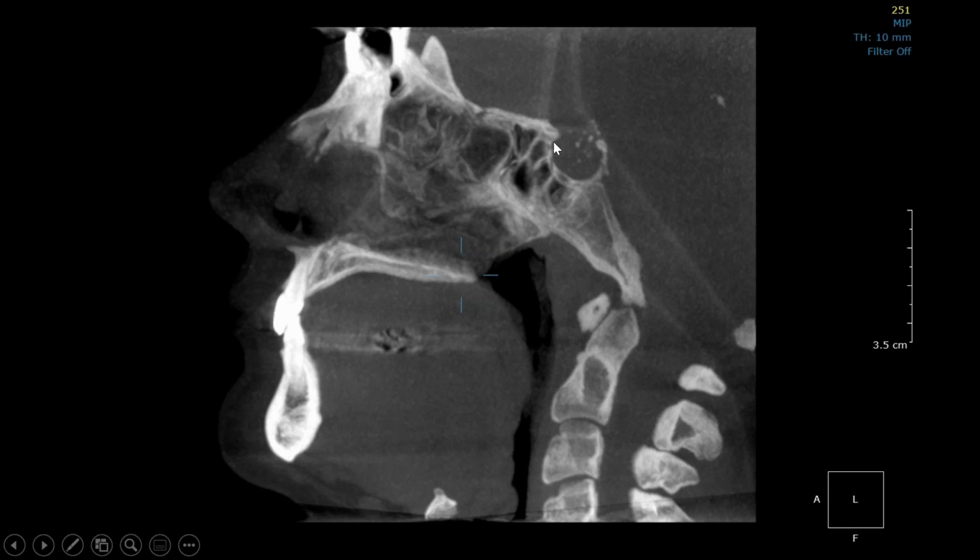There are lots of hormonal secretions that the pituitary manufactures, so there will be usually clinical signs or symptoms, and it behooves you to study up on some of that as well. This is a calcification, a physiologic one in the pineal gland, and it's normal. It's only abnormal if it gets to be bigger than a centimeter.